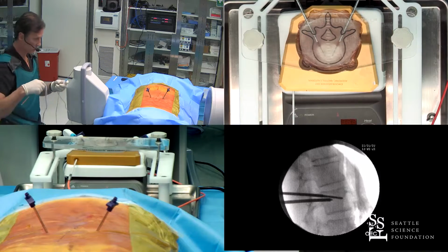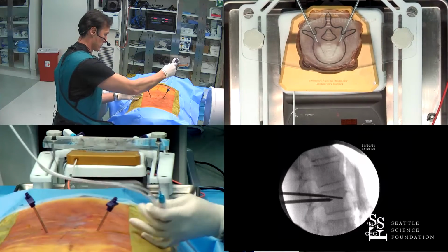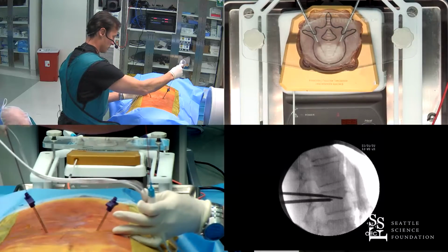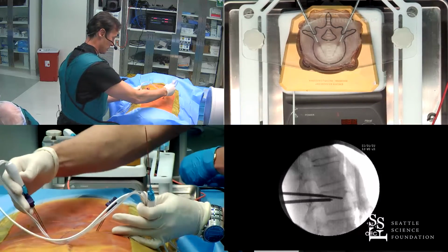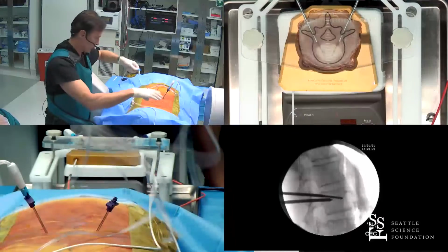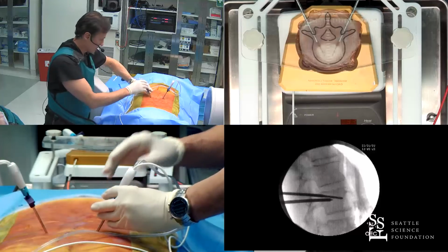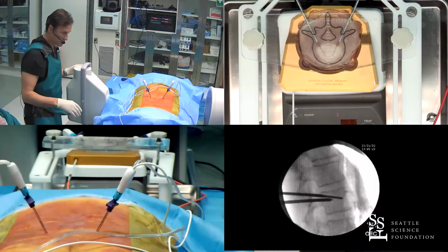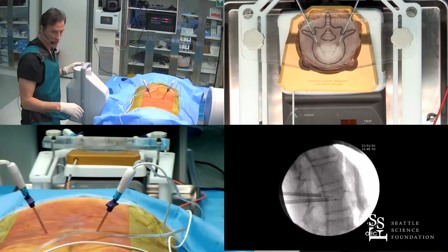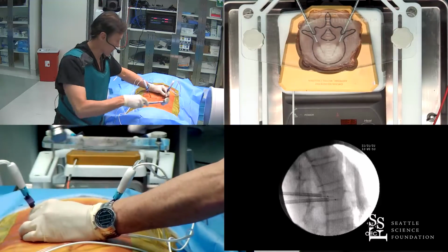Just want to put these in. This is the same thing we used in the ablation here. It just fits over the top of that, with two of the appropriate sized ablation needles. It's color coded based on how big it is. Then we will place these in the appropriate position.